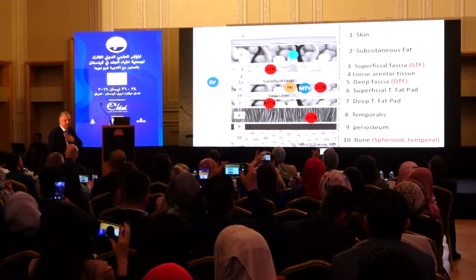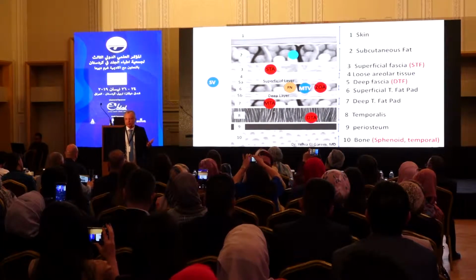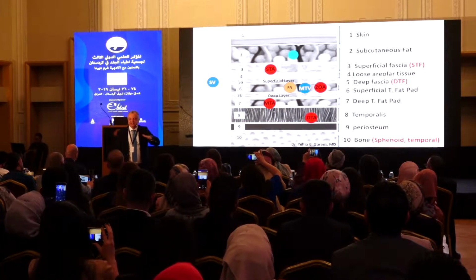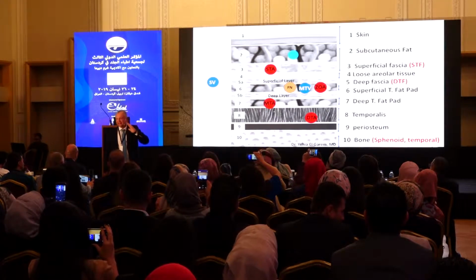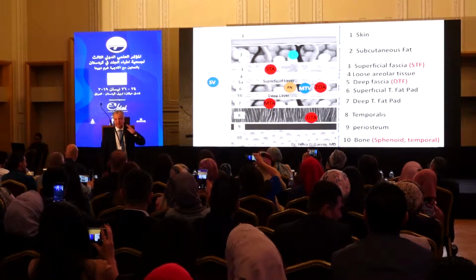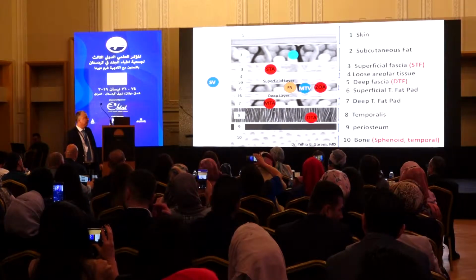I always recommend not to inject by needle in the lower temporal compartment. So what I can do, if I want to do more augmentation of the temple, is inject very superficially, at the subdermal level, using a cannula. Please do not use needles in this area at all. If you want to inject this lower part, inject it by cannula at the subdermal level.